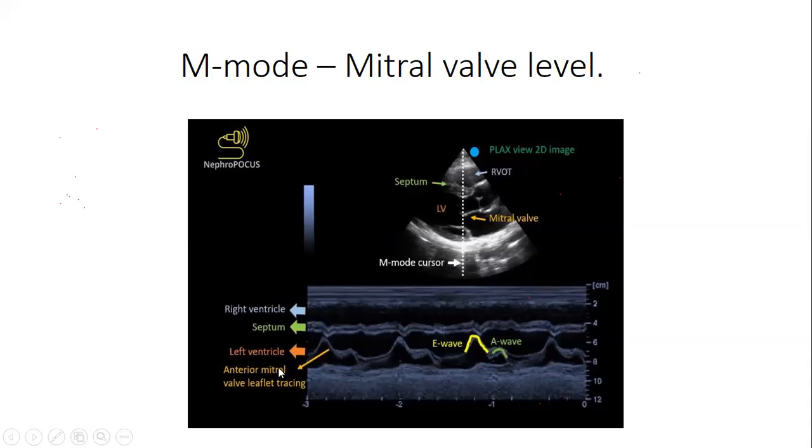This is the anterior mitral valve leaflet. And this is the anterior mitral valve leaflet. This one here. And this is the posterior mitral valve leaflet. This bright thing, it's a pericardium. And then you've seen this, there is a dark part here. Just continue seeing the parasternal long axis views. It's a consistent structure. This is a descending aorta. Very, very important. Don't miss that structure. That is the descending aorta. And you need to understand it from that view.